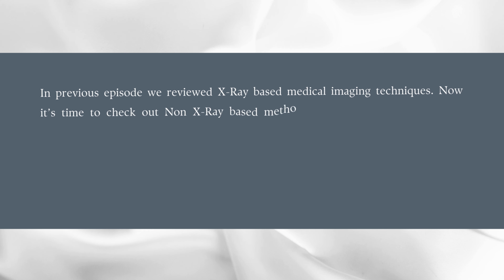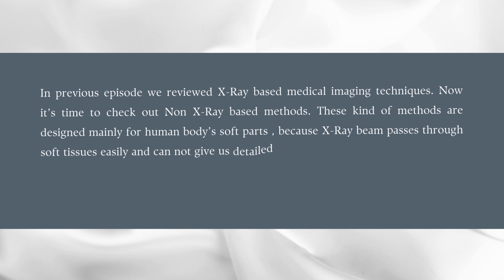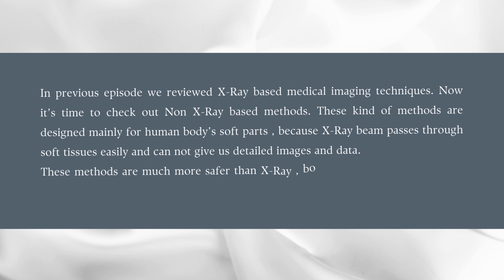In the previous episode we reviewed X-ray based medical imaging techniques. Now it's time to check out non-X-ray based methods. These kinds of methods are designed mainly for the human body's soft parts, because the X-ray beam passes through soft tissues easily and cannot give us detailed images and data. These methods are much safer than X-ray, both for patients and radiology operators.